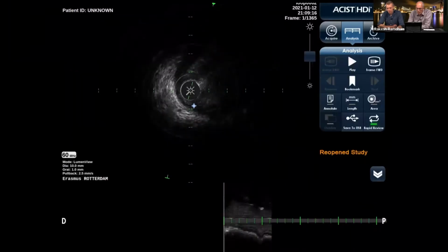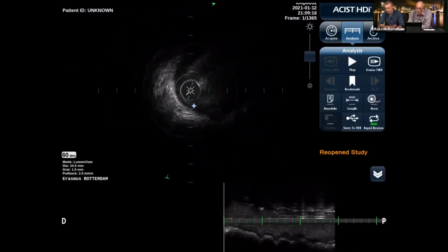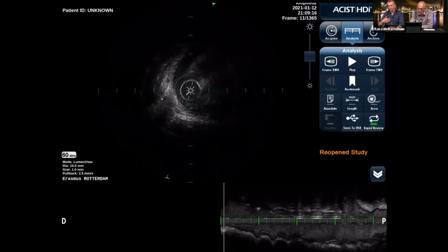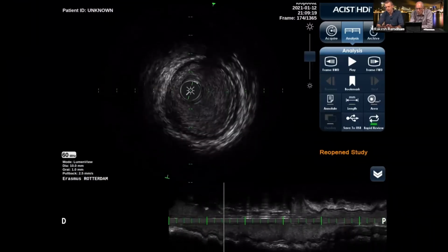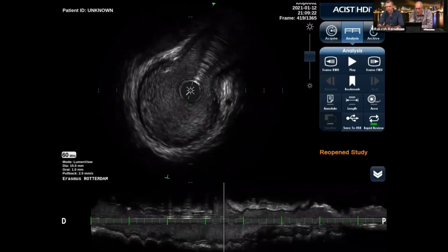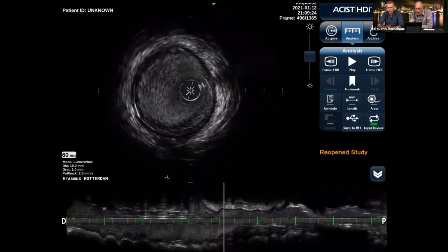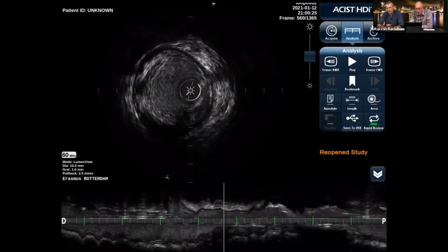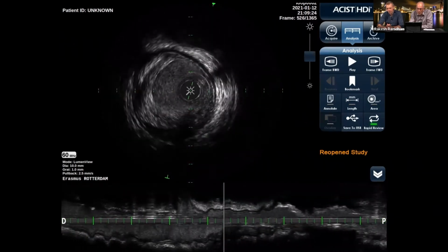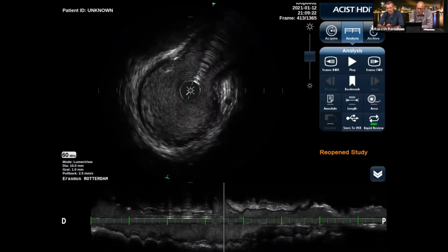That's one of the critical reasons why we did the SPECTRUM trial, to assess what types of thrombus and lesions might benefit, for instance, from thrombectomy or specific types of 2B3A inhibition. These are data that will hopefully follow by the end of the year once we have analyzed the data.